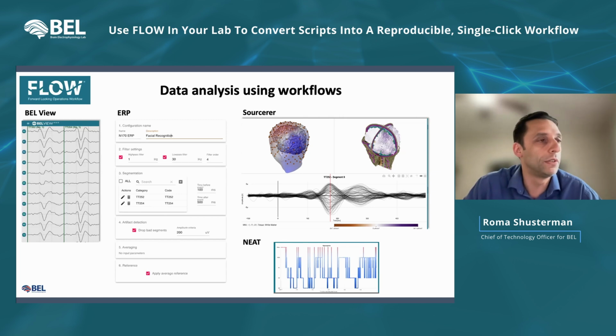And, you know, as an active researcher, I understand the lack of flexibility required for exploratory research. So to address this, a few years ago, we introduced support of Jupyter notebooks.